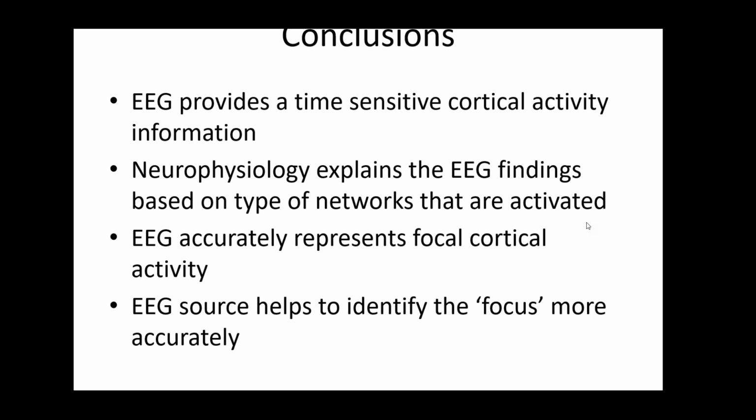All right, we have a couple more. Can we identify certain epileptic microcircuits with the scalp EEG or the intracranial EEG? No, they're microscopic. I don't think that what you basically see is the local network.